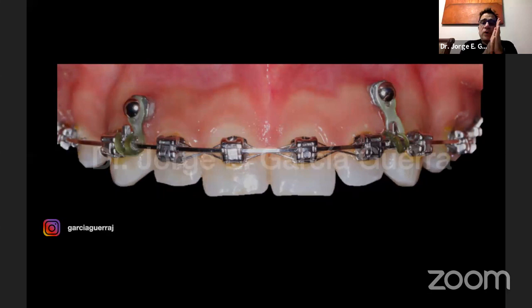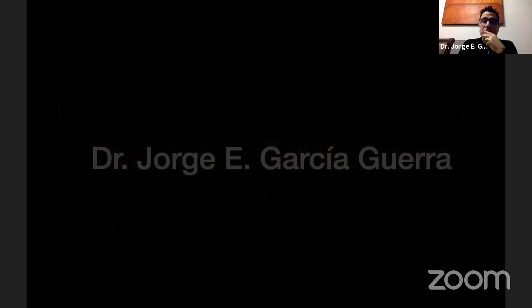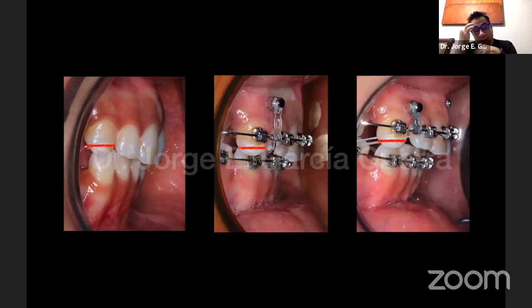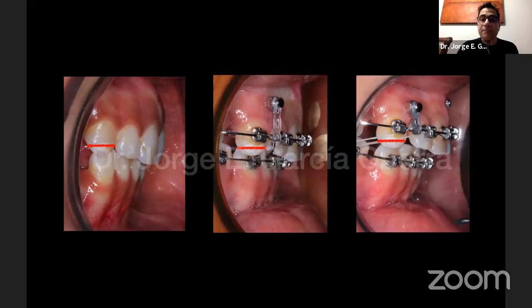Now, we're going to start talking about some information. Like in this case, you can see on the left side, this patient had a treatment from another office. So when she came to our office, she had a great overbite. So what we did in this case, we put the mini implant so we can intrude the anterior segment. And once we got the correct overbite, we started closing the spaces. Now you can see the difference, or the way that we corrected the inclination of the incisors prior to the closure of the space, okay?